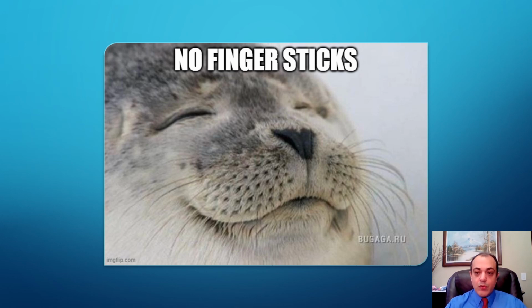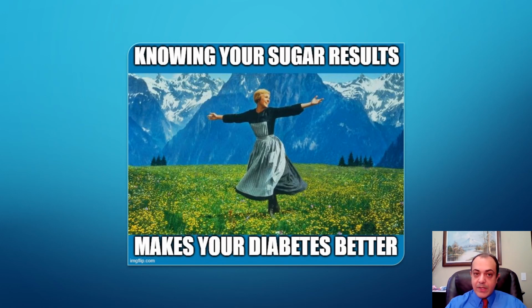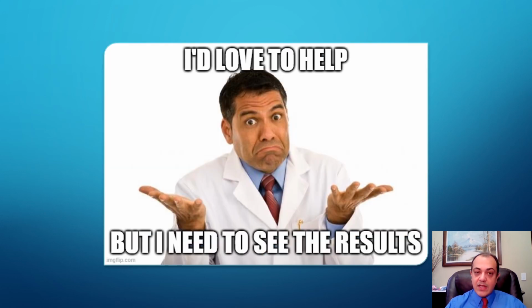First of all, the glucose sensor systems mean no finger stick. Great thing. That makes you happy. That makes you know your blood sugar results, but you cannot share them with your doctor unless you are able to use the technology in order to share the results with your doctor so that he can act on these results and change your treatment and help you.